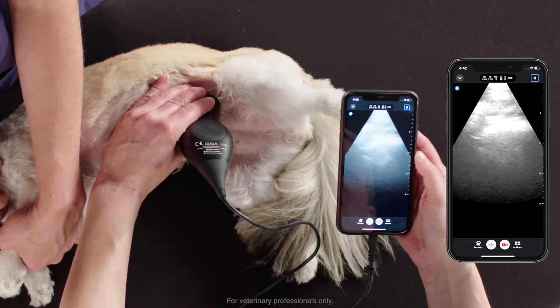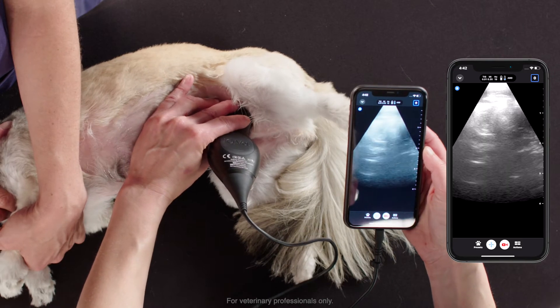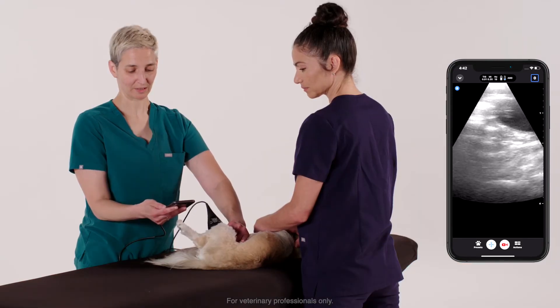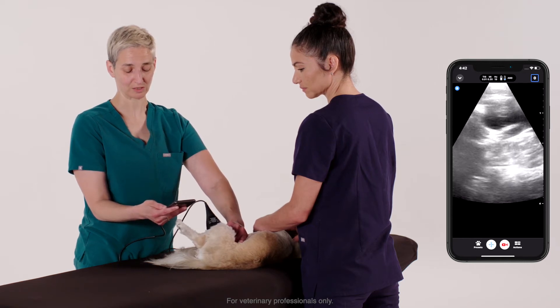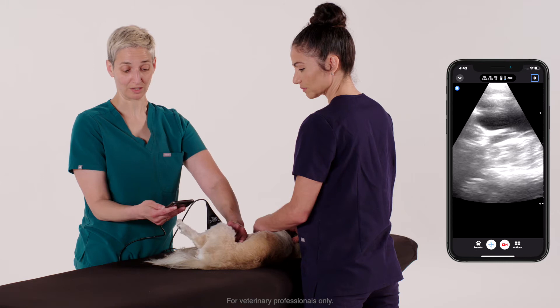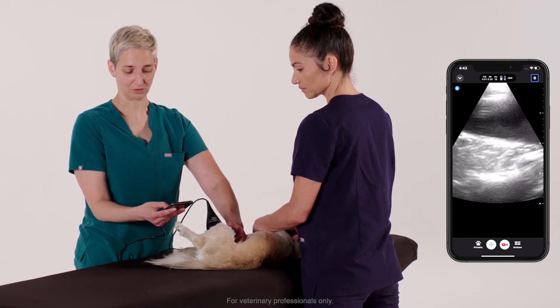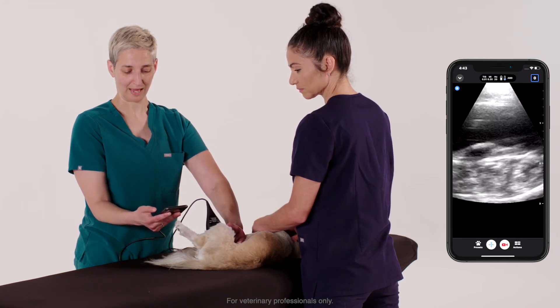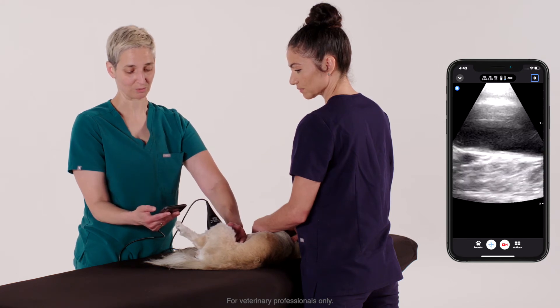Having gotten that view, I'm now bringing the probe caudal and a little bit medial to pick up my bladder. I'm looking now at the apex of the bladder, looking for any early signs of effusion. One of the first places where effusion in the abdomen will collect is just cranial to the apex of the bladder. I can zoom in a little bit on the bladder to look for any bladder wall abnormalities or any intraluminal abnormalities such as bladder stones.